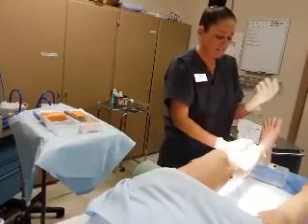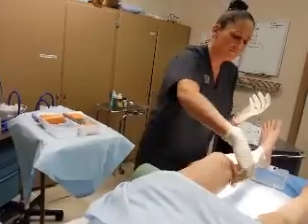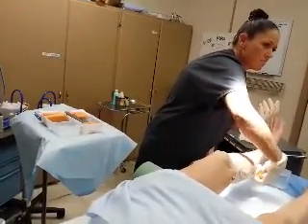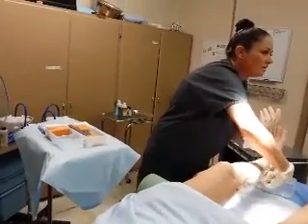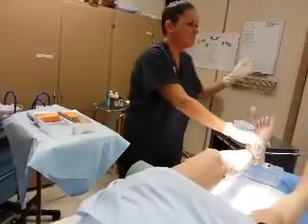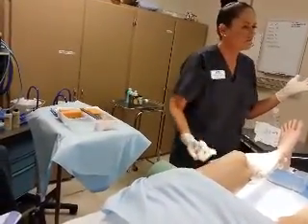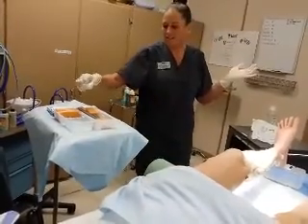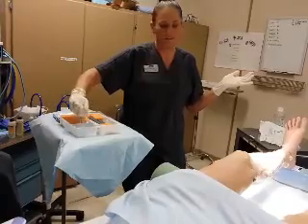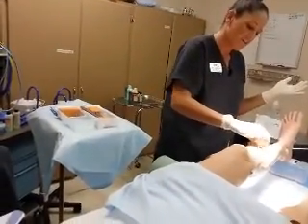Unless you're leaning forward like that, then you've got to bring your arm out. If your hand does touch, like the foot, can we ask you to not use it anymore or get another glove? If that left hand touched the foot, so if I did this, just ask for a new glove? At this point, I would just put my hand out there, and I know that hand's no longer usable. If I needed to, I could ask for a glove or I could just open up another pair of gloves. Then start at the incision site.